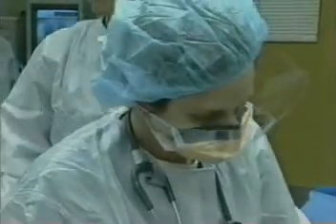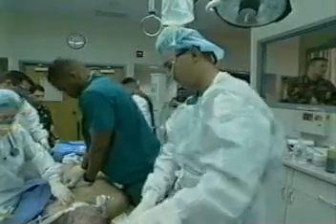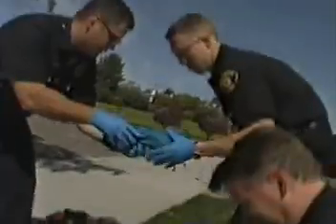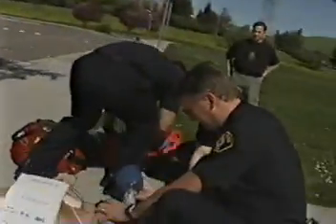The AutoPulse is an automated version of cardiac massage, or CPR, a technique first developed in the late 1950s by William Bennett Kouwenhoven of Johns Hopkins University. Despite the widespread use of the technique, hundreds of thousands of people die of cardiac arrest every year. The chest compression technique has remained largely unchanged until the invention of the AutoPulse. Now, this civilian medical technology is being used by the U.S. Marines.